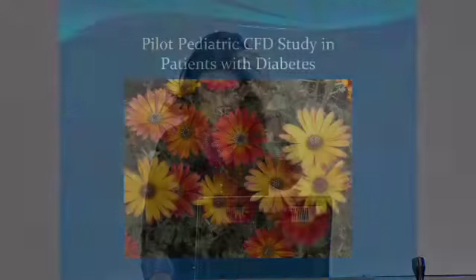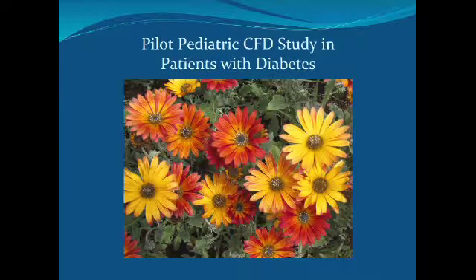And then you go over here and you look at the wall shear stress as modeled by Marquette's lab, and the wall shear stress was fairly low in the areas of high plaque, and the oscillatory shear index relatively high. So kind of interesting and very consistent with what has been published by other people.